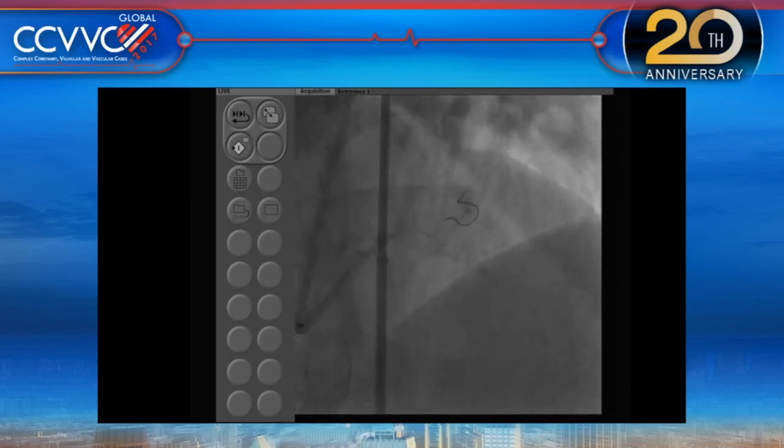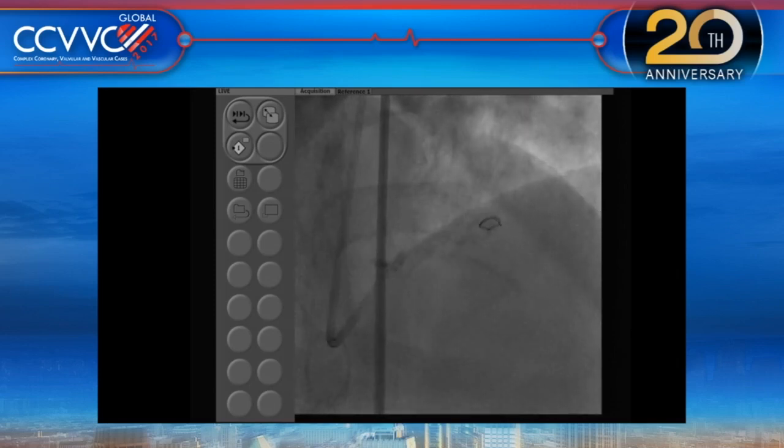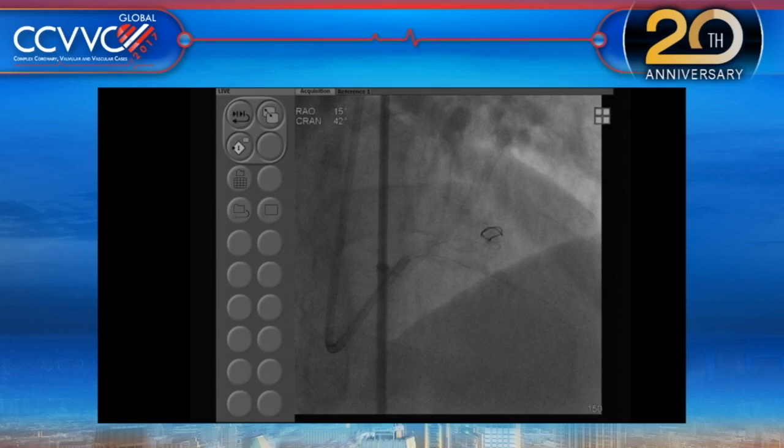I know that ILUMIEN 4 is already being planned with the OCT and the angiographic guidance in the complex cases. But clearly we saw, and the same in the DOCTORS trial using OCT, you get a little better lumen or better FFR in the group, but still, does it translate, just like what is done with the iFR and FFR, does it translate to the real good outcome? So that is the biggest issue that remains.